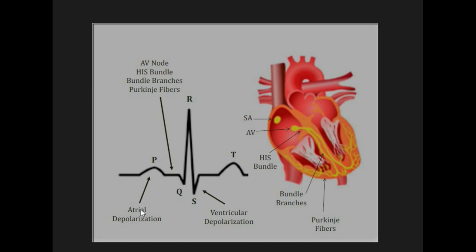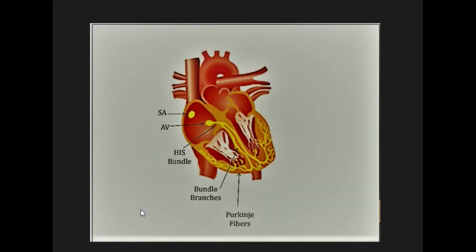Talha Aziz, and today the topic of my presentation is ECG. The basic parts of our video are going to be the axis determination of the ECG, how we are going to find out by looking at an ECG strip what the axis of the heart is, and the other part, where we are going to learn about the 5 steps of ECG interpretation. So let's start the video.